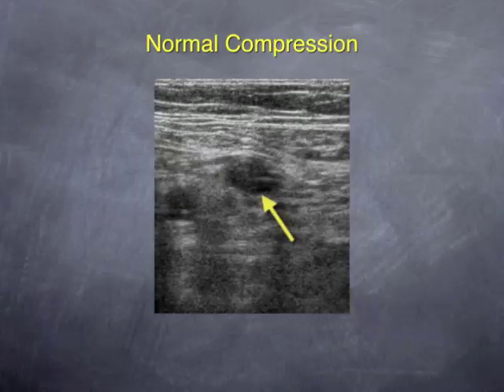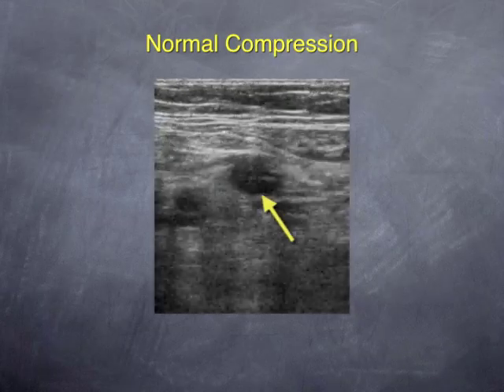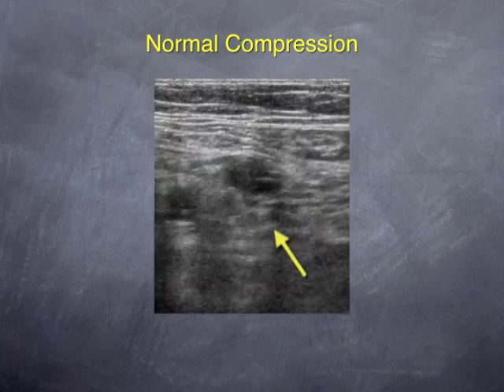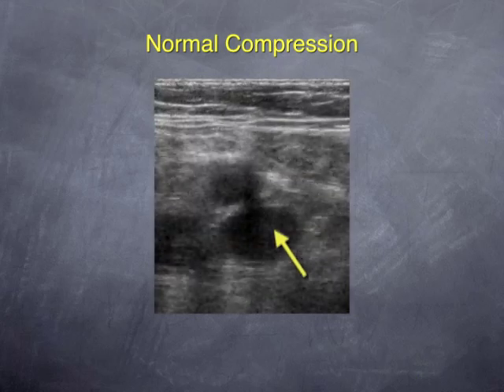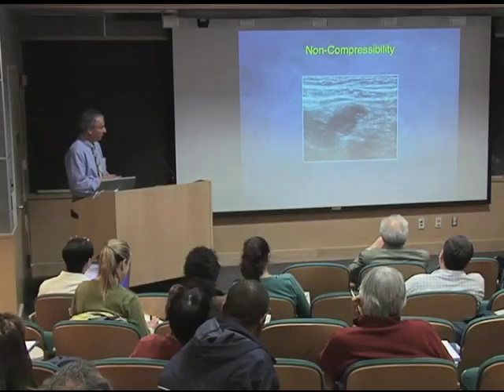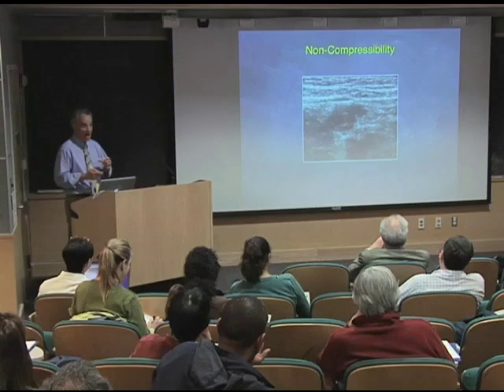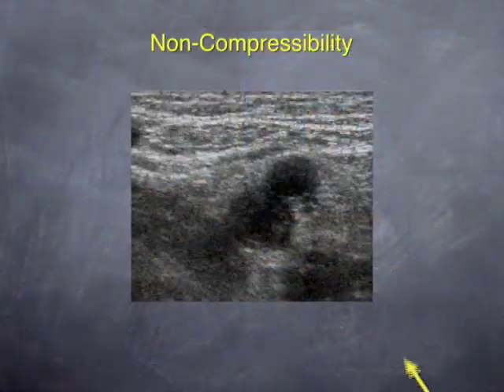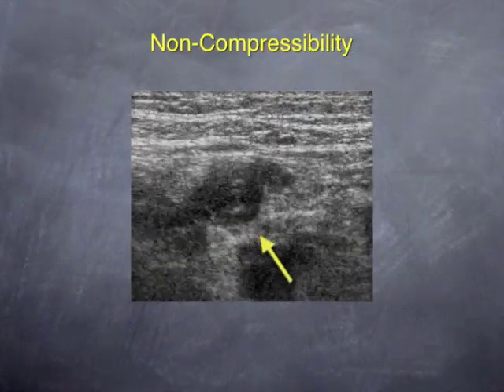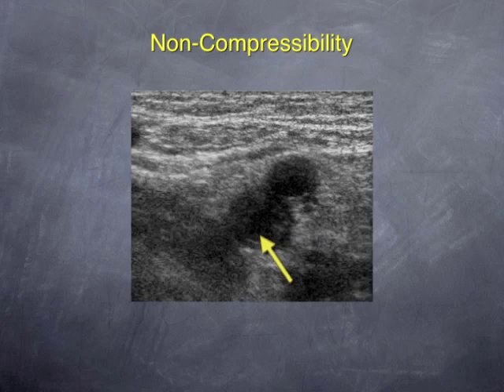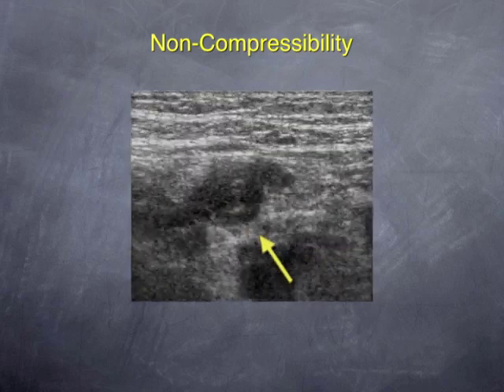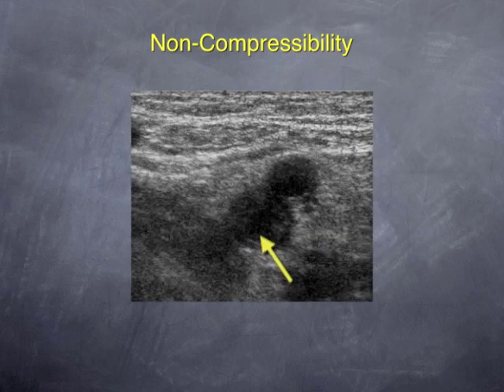This is the artery and we're pressing down, and you can see that vein compresses quite nicely — no evidence of clot within that vein at all. And here's an example of a patient that has a big clot in that vein. This is the artery and there's the vein. Instead of it squishing down to nothing, it stays the same, telling us that there's clot within that vessel.